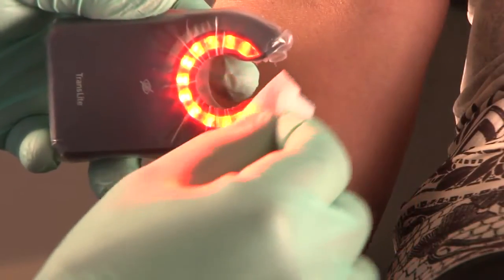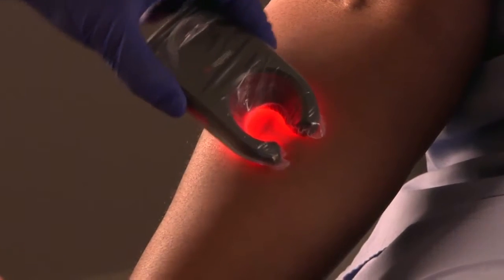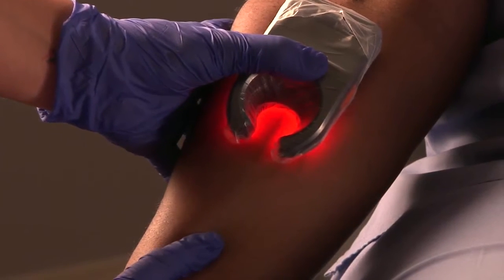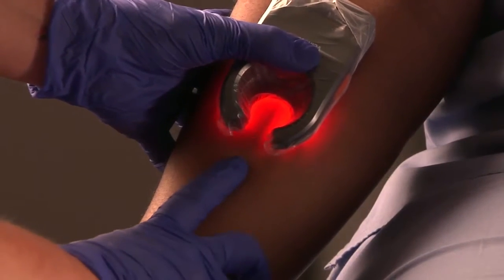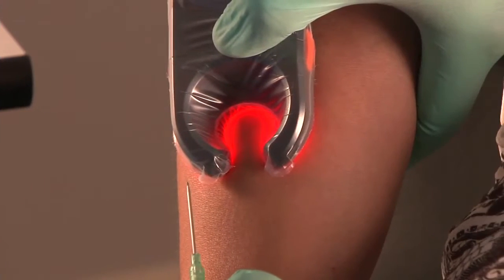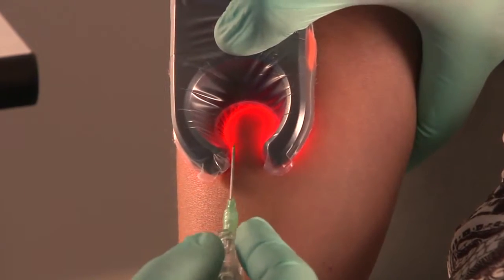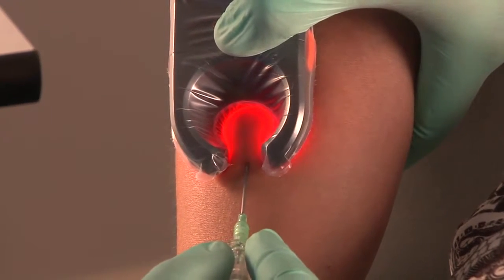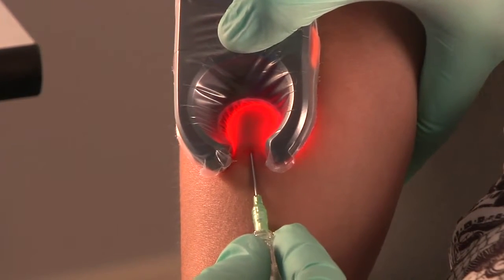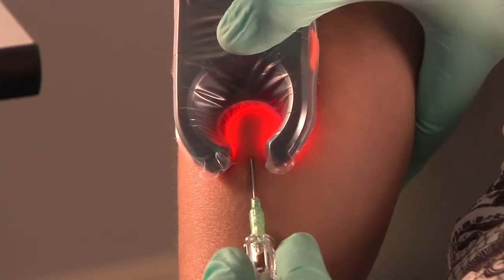Your VeinLight device and access site must be prepped in the same manner as any other IV access procedure. Rotate the device with the opening facing you. Place your thumb on top of the VeinLight, wrapping your four fingers around the limb. Gently squeeze the VeinLight into place. This action helps isolate the vein and provides optimal pressure for access. After closing the vein, slightly push back on the device. This will stretch the skin, raise the vein, give it traction, and prevent it from rolling. You are now ready to access your fully secured vein.